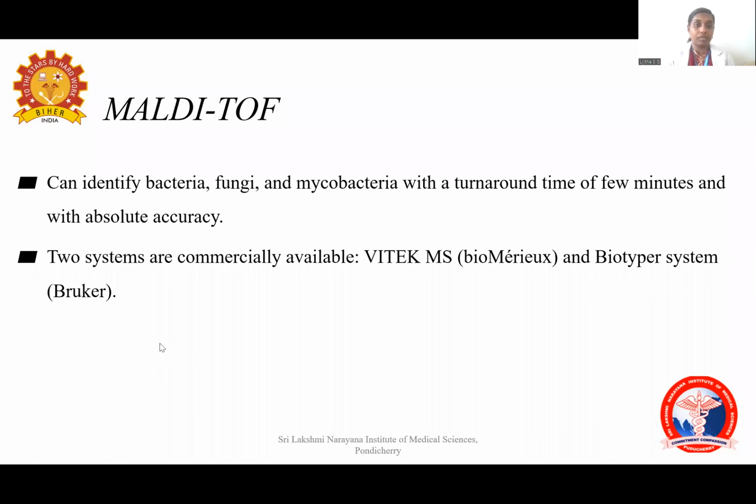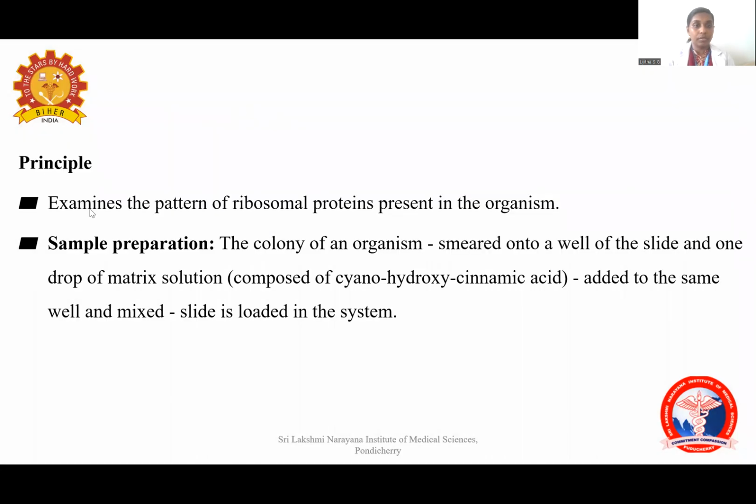These two systems work on this principle. The principle is that it will examine the pattern of ribosomal proteins present in the organism.